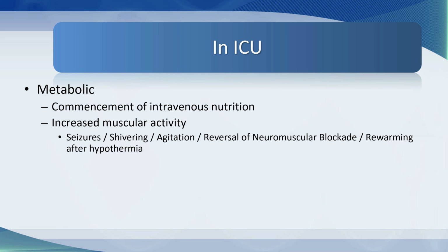Similarly, if there's any cause of increased muscular activity like shivering or agitation or seizures or reversal of neuromuscular blockade or even rewarming after hypothermia, then the end tidal CO2 will go up, particularly when the patient is rewarming because, of course, less CO2 dissolves in warm blood.